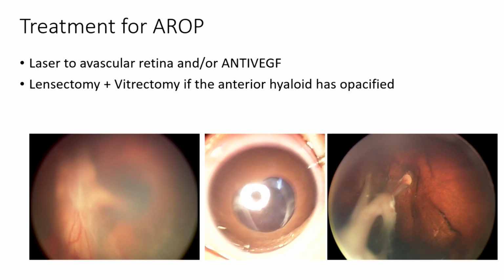You had given the good timeline, right? Yes, to be followed. So again the vessels start becoming angry. Angry means what? Dilatation, yeah, more dilatation. Again, new vessels: we start seeing proliferating new vessels at the vascular junction. So then we can suspect it is reactivating, and we will need to treat it. So even one quadrant or one clock hour of such things happening is an indication to go ahead and treat, yes, sir.